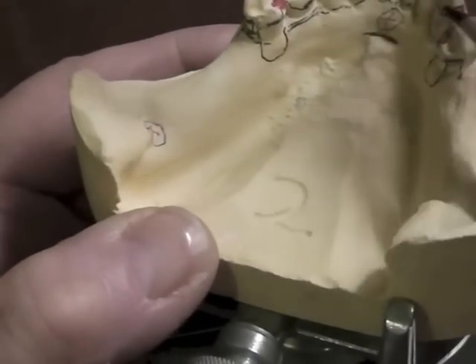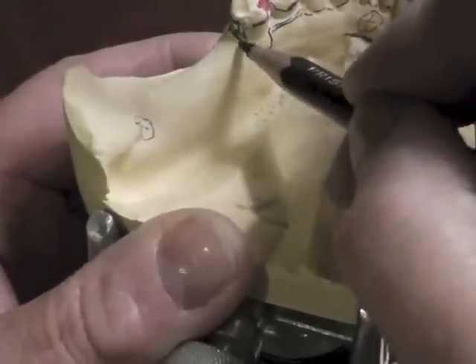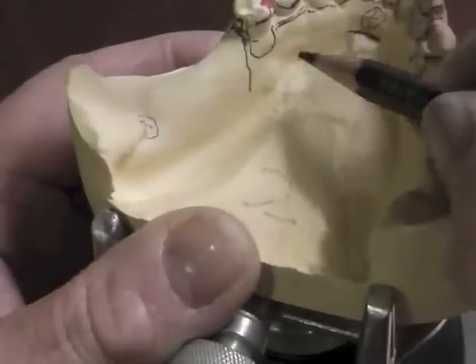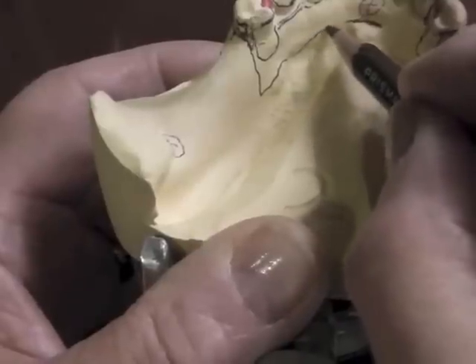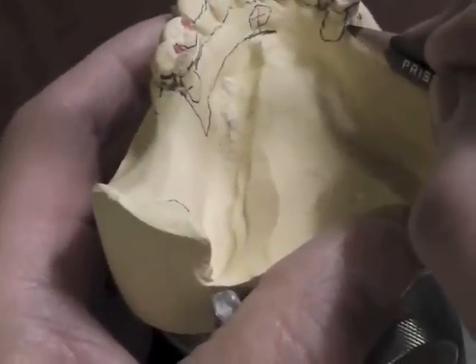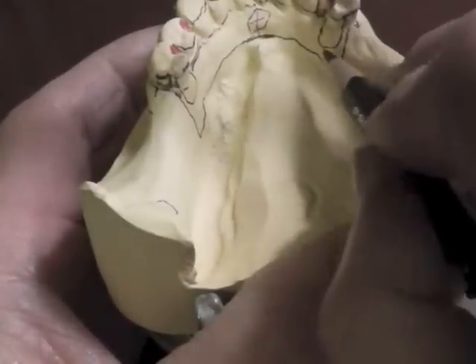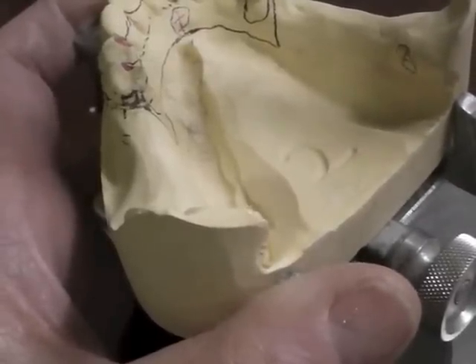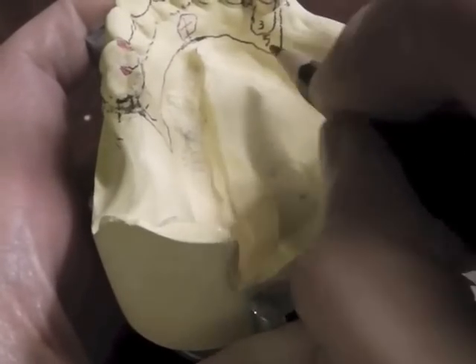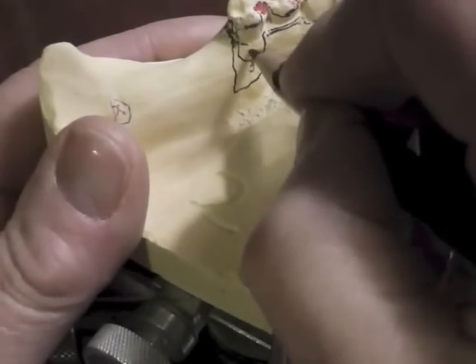Our major connector will come down at this line angle right here, basically to the functional floor of the mouth. I note a little bit of a torus there. I come around and join here. This portion should be five millimeters in width — I didn't quite make five millimeters so I really should lower that a bit. This should be three millimeters clearance from the gingiva up here. So I would be taking my major connector down a little bit from there, making it five millimeters wide and three millimeters clear of the gingiva.